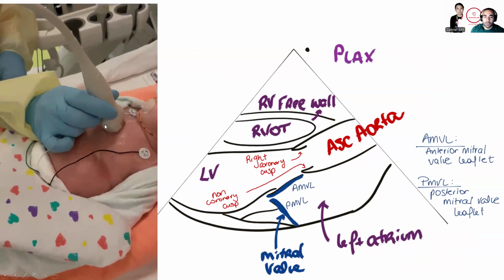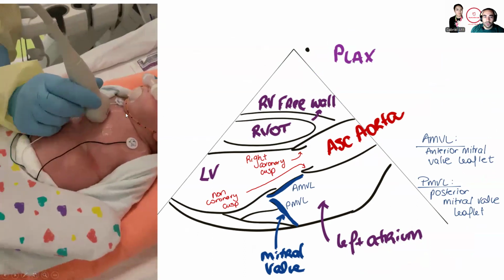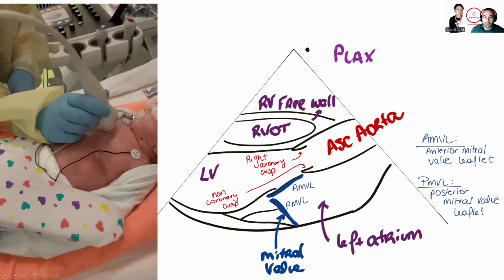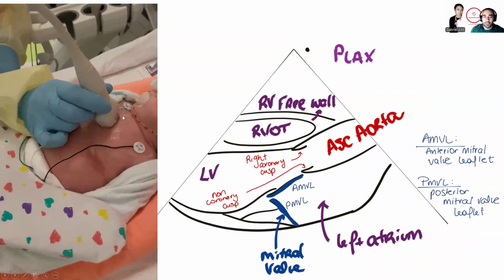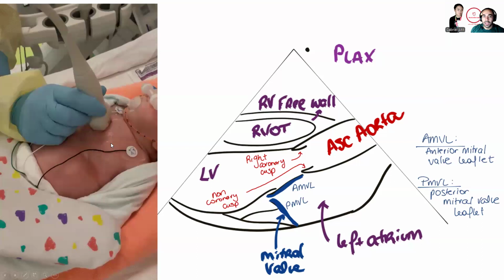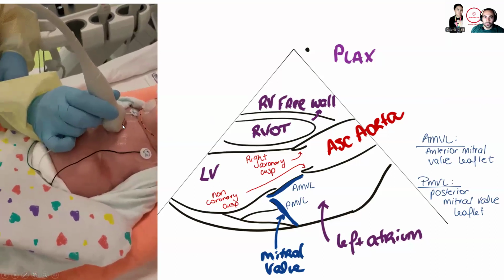So here's an example on the baby. You can see that the nipple line is around here. You can see that the suprasternal notch is around here with kind of the neck area. And really the probe is typically around midway or slightly closer to the chin actually, in order to obtain the image of the long axis of the heart and the parasternal zone.